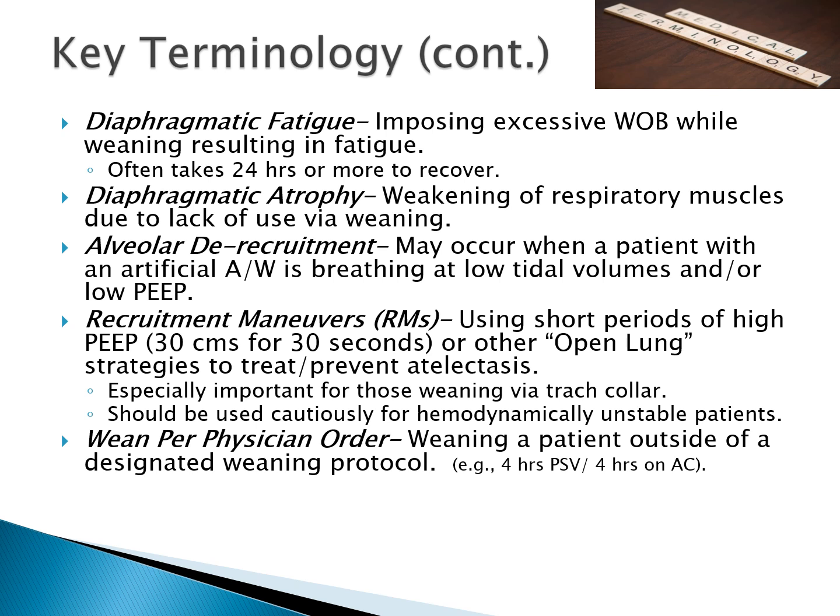So recruitment, there's a lot of different approaches that can be used. The latest evidence is really pointing closer towards using an APRV-like approach. But again, the 30-30, in some cases 40-40, that is 40 centimeters of PEEP for 40 seconds, as long as the patient can tolerate it and they're not hemodynamically unstable, those can potentially offer some benefits.